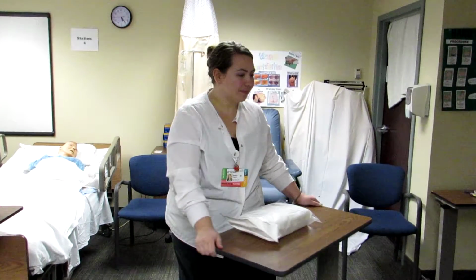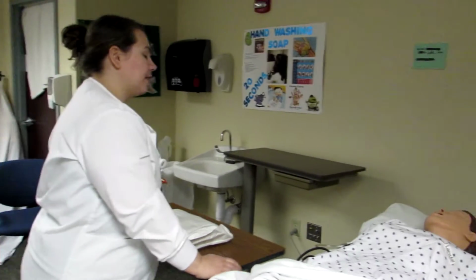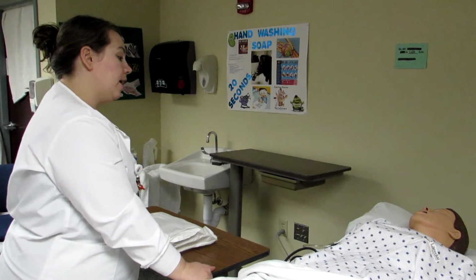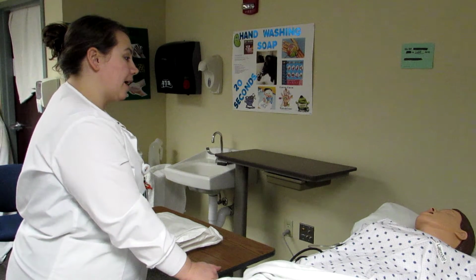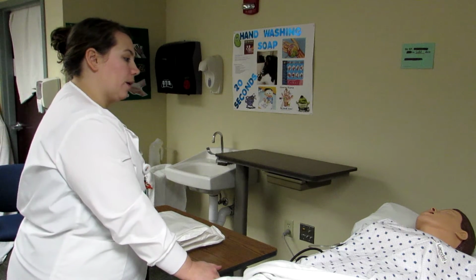We're back. Hi, Mrs. Smith. I'm Shane. I'm going to be your student nurse today, and the physician actually wants me to place a Foley catheter. So you're having some problems voiding after surgery. He wants me to put a catheter up into your bladder to help you relieve some of that urine that's in your bladder. Probably going to take me about 10 minutes. Might be a little uncomfortable at times, but I'm going to talk you through it and let you know what I'm doing at all times.